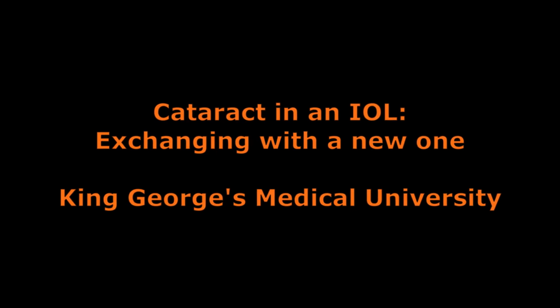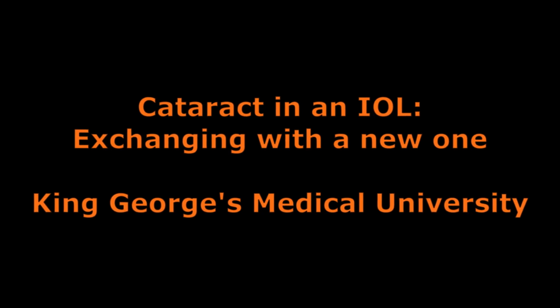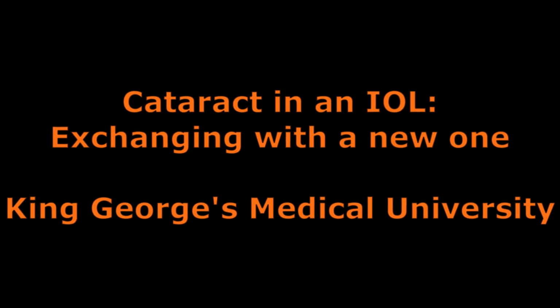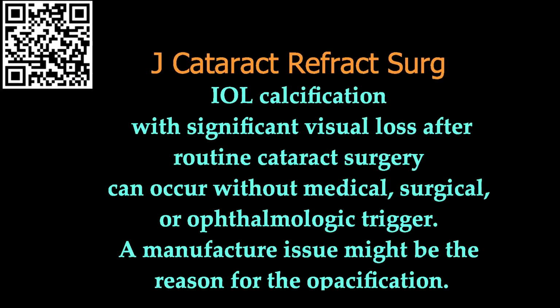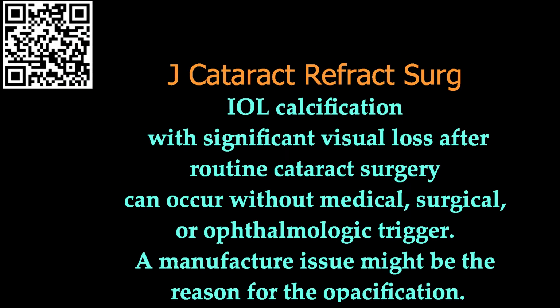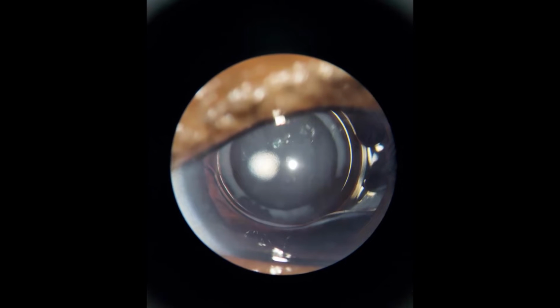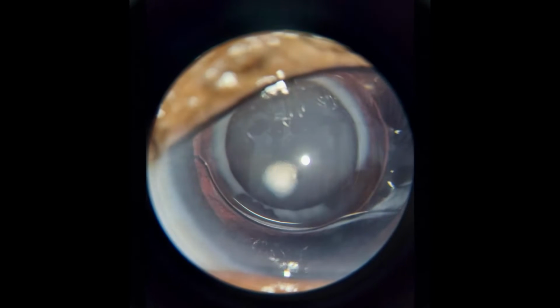Hello friends, today we'll see this much awaited video of mine in which we will see a tertiary cataract, or cataract in an IOL. Now this lens opacification has been described in literature and two forms have been recognized, one is glistening and the other is calcification.